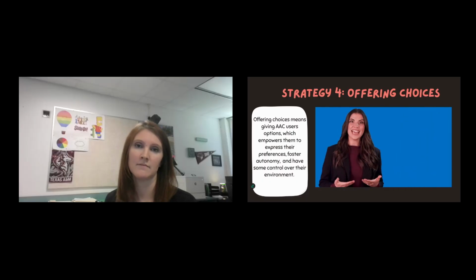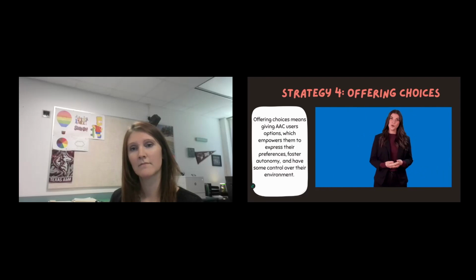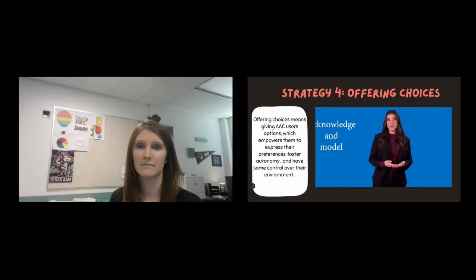Your partner may use the AAC device to make his or her choice. However, he or she may also communicate a choice by gestures, reaching, or other types of reaction. That's okay too. If your partner makes a choice that is clear to you, but through other ways of communicating, you can still acknowledge the choice and model it on the device.